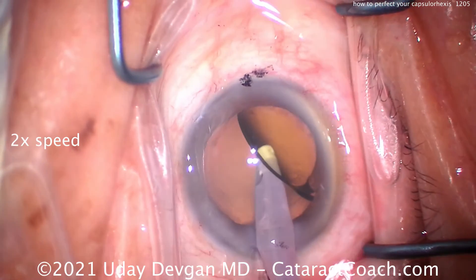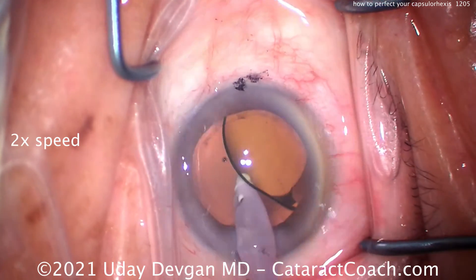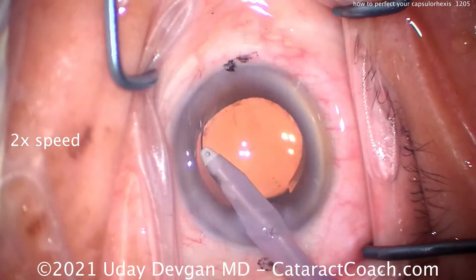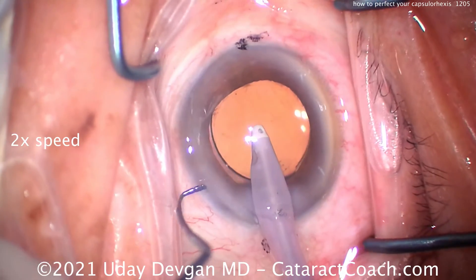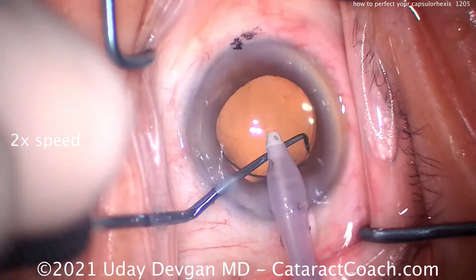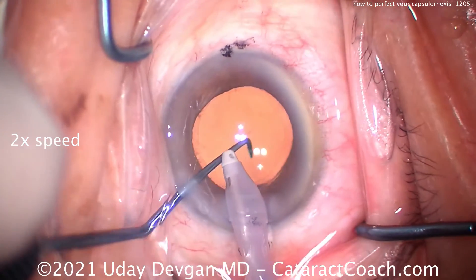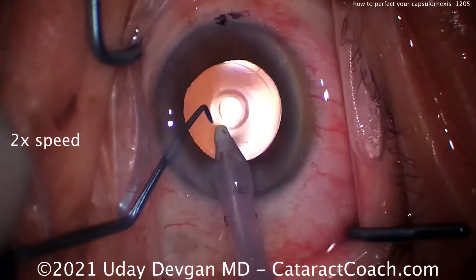This is all part of perfecting your technique, making your surgical signature as pretty as possible. Remember, every ophthalmologist or optometrist who looks at this eye any time in the future — 5, 10, 20 years from now — what are they going to see? They're going to see your capsorexis and they're going to see your incision, so make both of those as beautiful as you can.